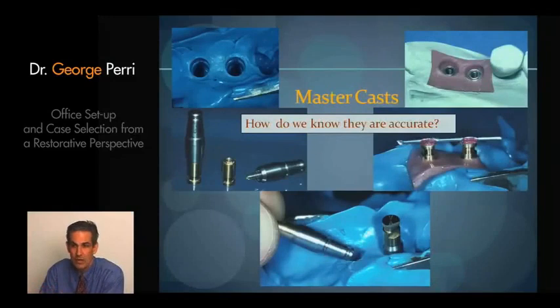Now it requires a certain amount of unpredictability so that when the restorative dentist goes to the mouth, they have to ask, will my crowns fit? Even if I have interproximal contacts, will they be heavy or open? I have unknown. I don't like unknown. If I'm doing a bridge, will I have to solder? Will I have to separate that unit? And that's a great, sometimes difficulty in terms of evaluating that.